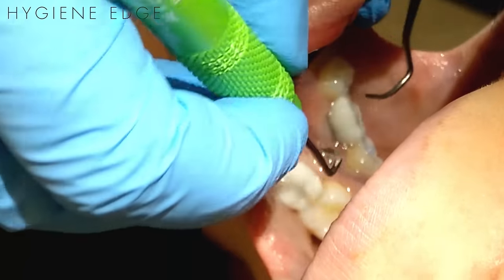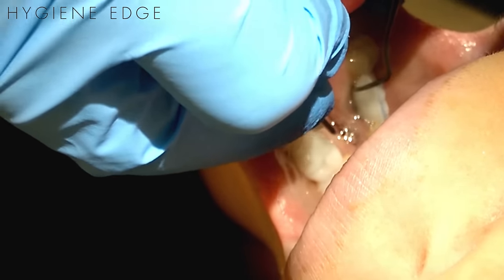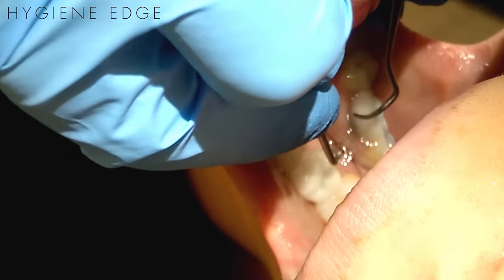If only biofilm is present, you want to use a light, exploratory-like stroke around the implant. If there is calculus, then you can use a calculus removal stroke with a little bit more lateral pressure.